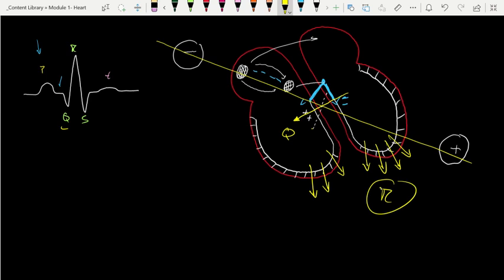And then as we follow these fibers, you can see we're starting to become perpendicular with my lead axis. Right there, I'm really perpendicular. Where am I? I'm kind of back over here at baseline. But my last little bit, we can do this on the right side too.